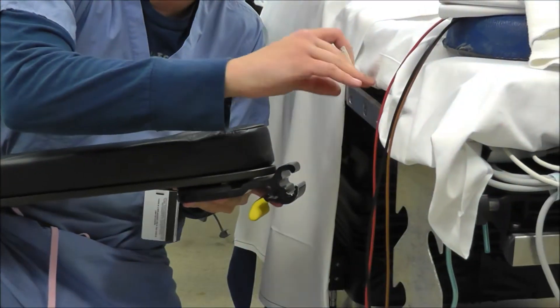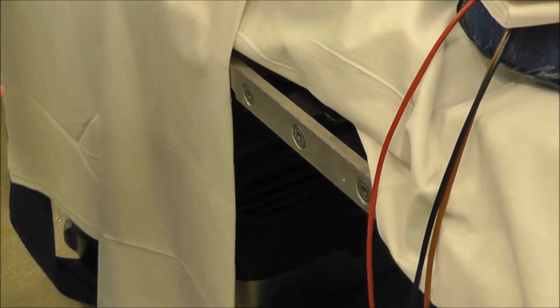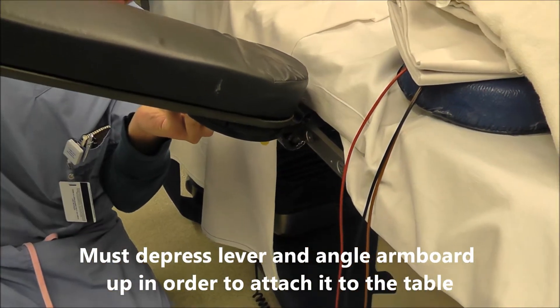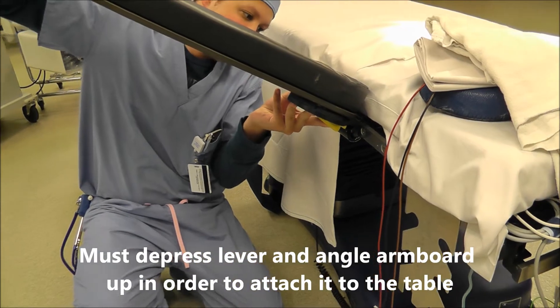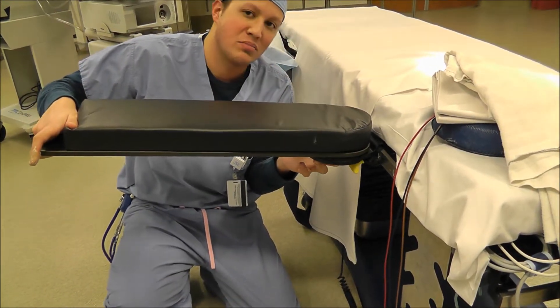If you come over here, you'll see there's a groove where it'll sit perfectly. You want to hit the lever and go in like this until it sits right, and while holding the lever down, drop it and it'll click into place.